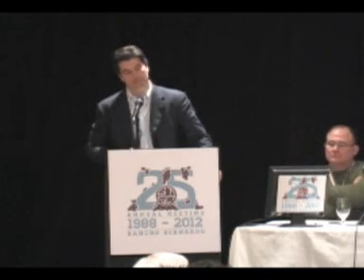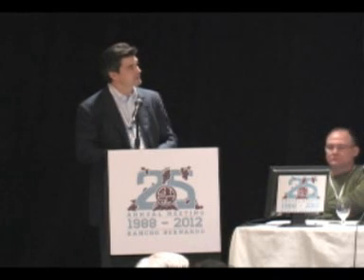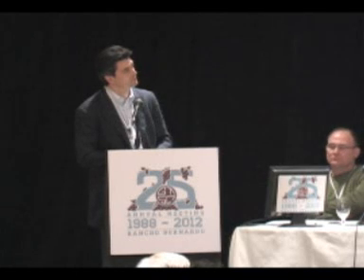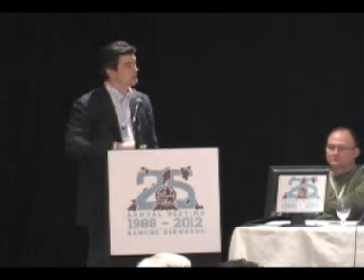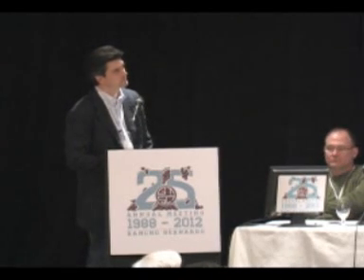When I'm teaching residents to do this, I tell them the easiest way to go in first and to get an orientation of the anatomy is to go into the right mainstem and then flex anteriorly, and you're going to start seeing the pulmonary artery, the right main pulmonary artery coming across the right mainstem bronchus, which is sort of shown here. Now, when we do the EBUS, the image is sort of flipped. But here is the right main pulmonary artery.